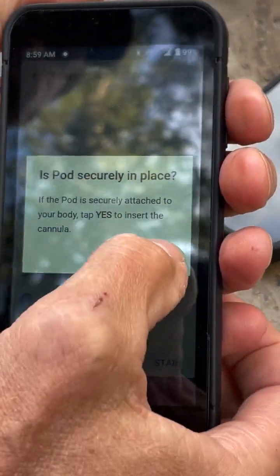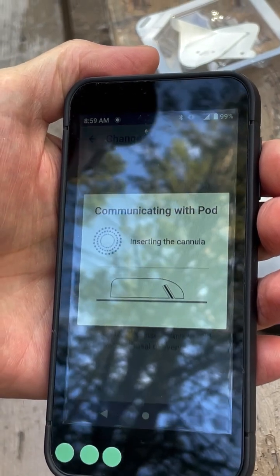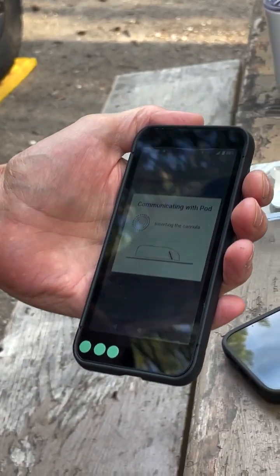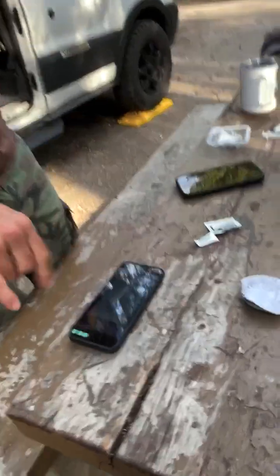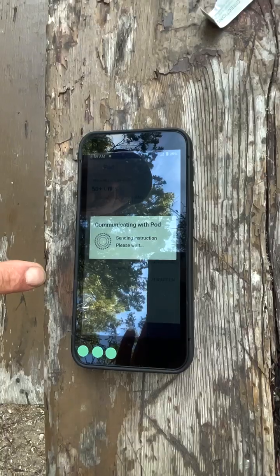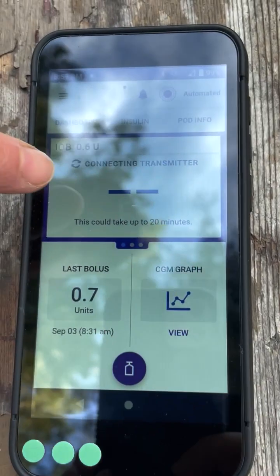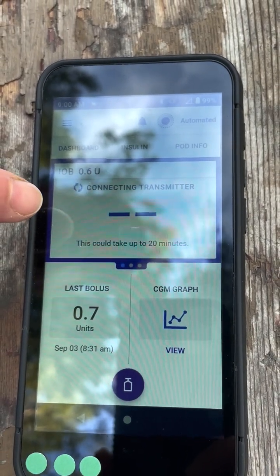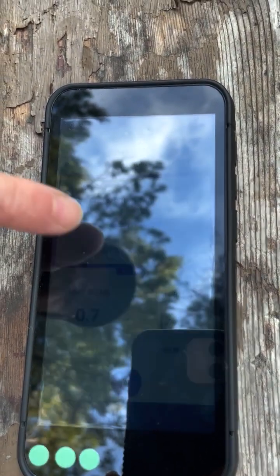I'll go around and make sure it's secure all around and push it down real good. Pod securely in place — yes. At this point it primes the pod a few more times and then it's going to inject a needle into my skin. There it goes — just injected the needle. I'm going to confirm that yes, it inserted. Automatic mode — it's turning on automatic mode. Now I'm ready to go. You can see it's connecting with my CGM, and that can take up to 20 minutes. I've only had one time in the last two and a half months using this system that it hasn't connected and I had to tell it to reconnect again, and it did — that was not a problem.